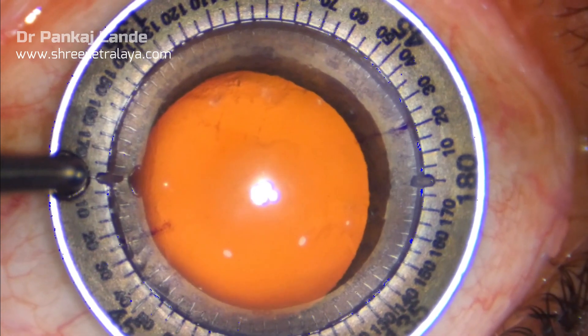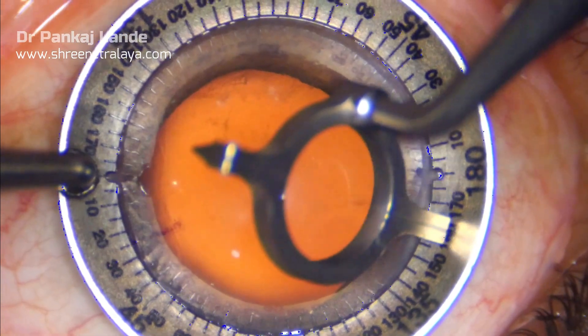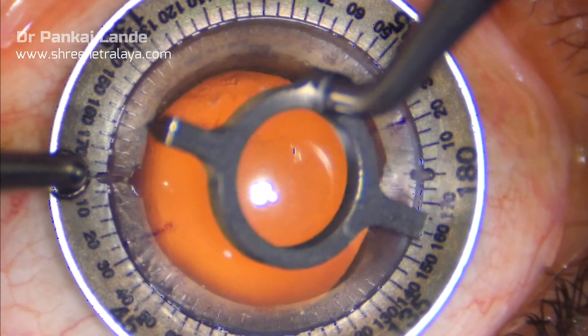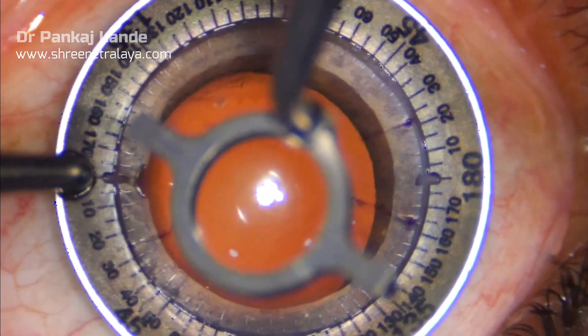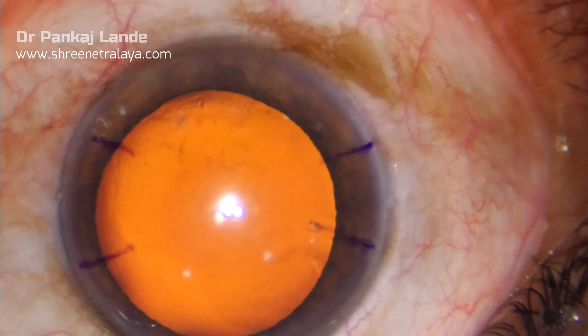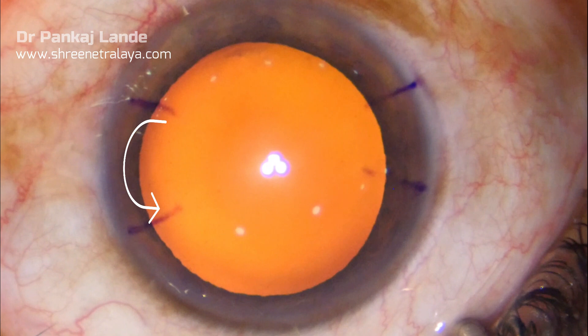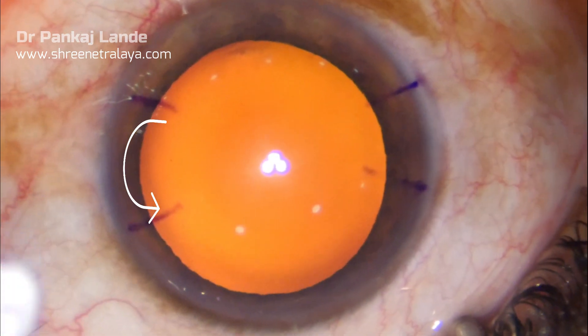I am marking the locations where I am supposed to do the LRI. I am taking the opposite side marking also so that I can avoid my phaco incision in that location, as that can flatten the cornea slightly more because of surgical induced astigmatism and can give excessive flattening.